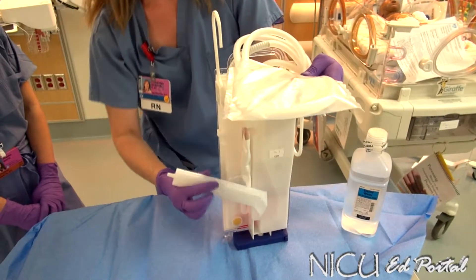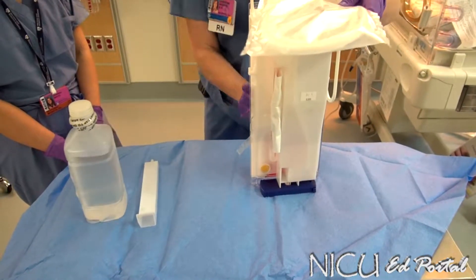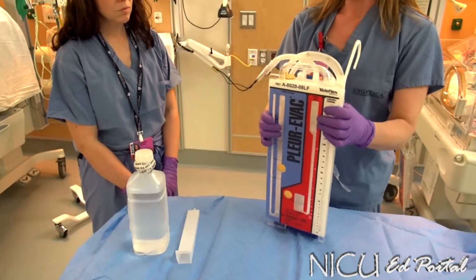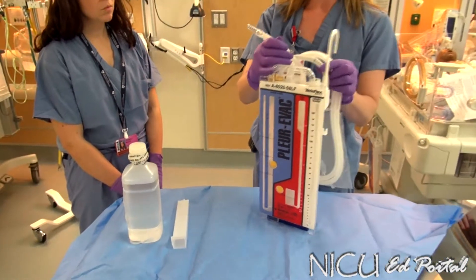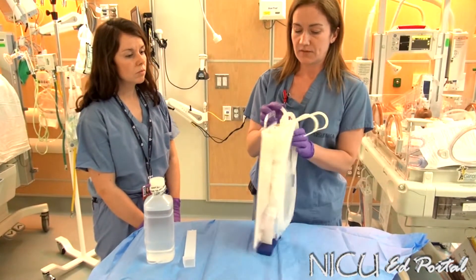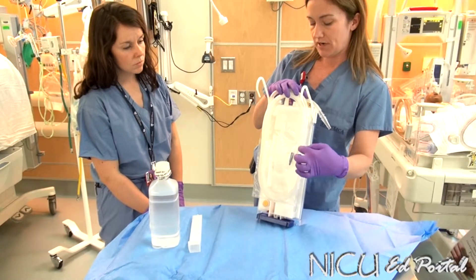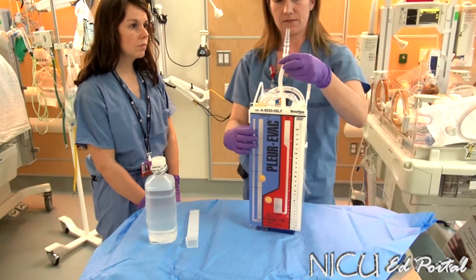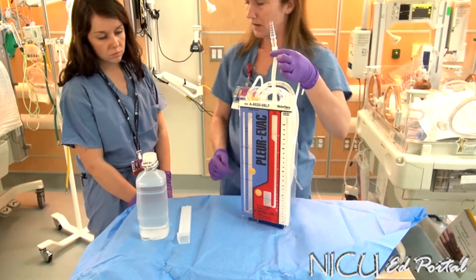You'll need your funnel, your sterile water, and your system. When you take it out of the package, make sure you're familiar with each port. This first port is what we're connecting to the baby. This blue tip is keeping the end of that drainage system sterile. This other port is what we're going to use first — filling the water seal chamber up to the two centimeter water line.